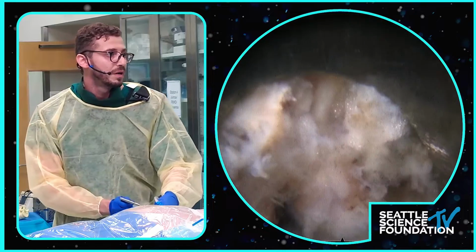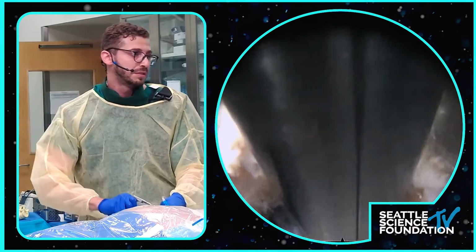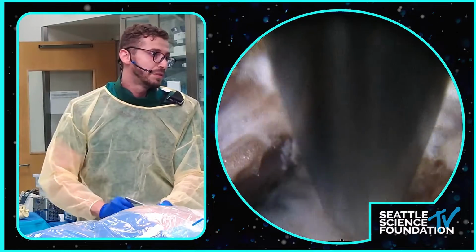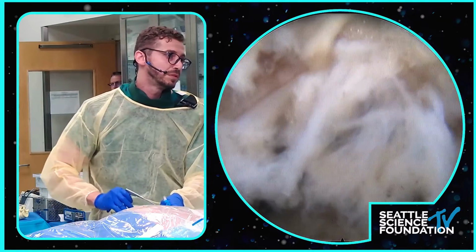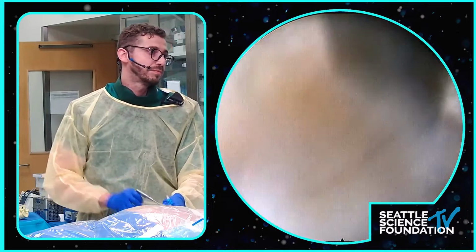One thing I think is spooky when you're just starting out doing transforaminal is knowing where the exiting nerve root is. How do you, when you're starting out, get comfortable knowing where that's going to be, predicting where it's going to be, avoiding it, finding it?